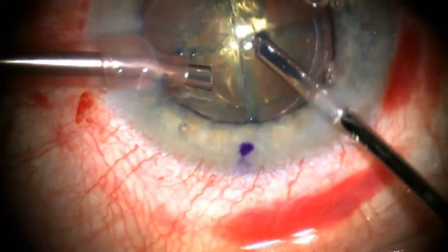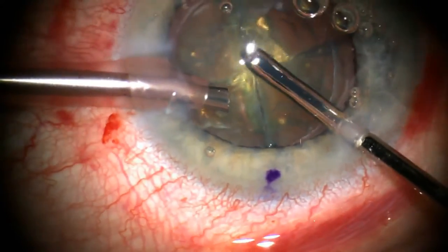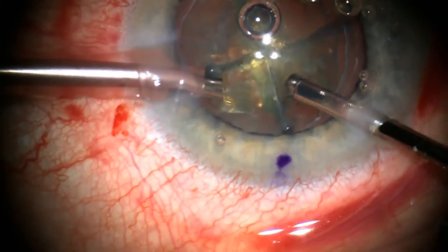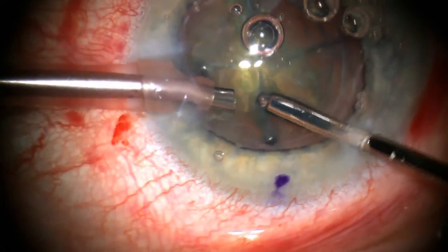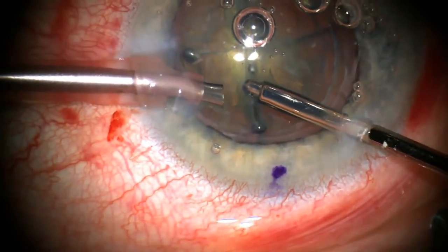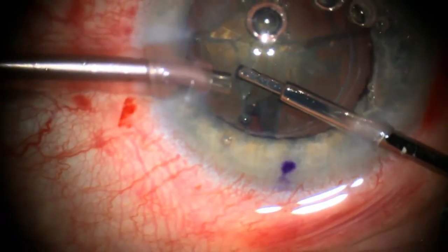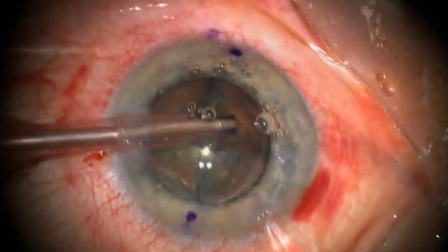A new coaxial chopper is now being used to further divide the quadrants. The advantage of this coaxial chopper is that it can be put through a very small 0.8mm incision so that access is improved to split apart the four quadrants.